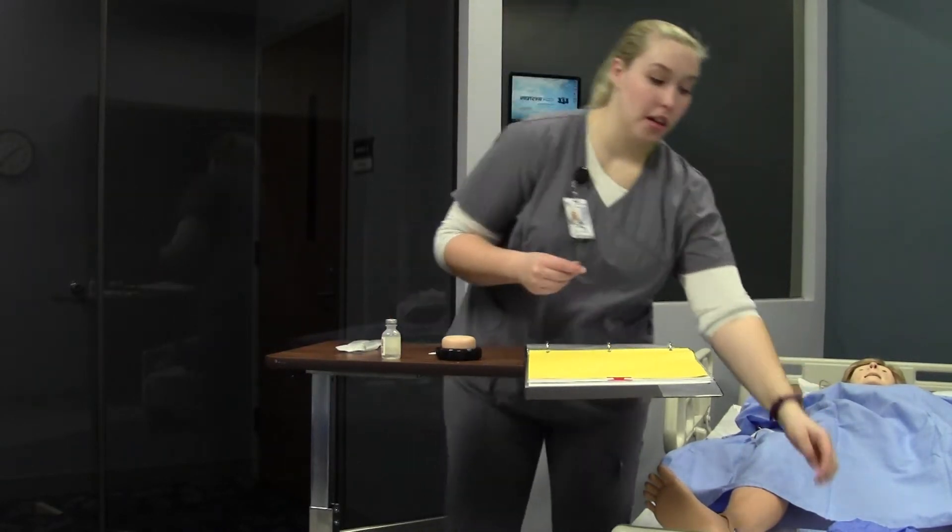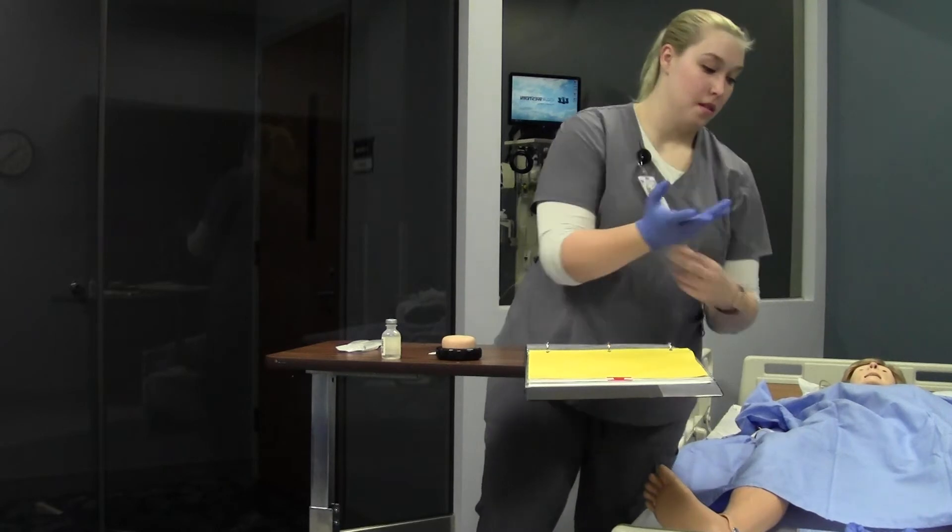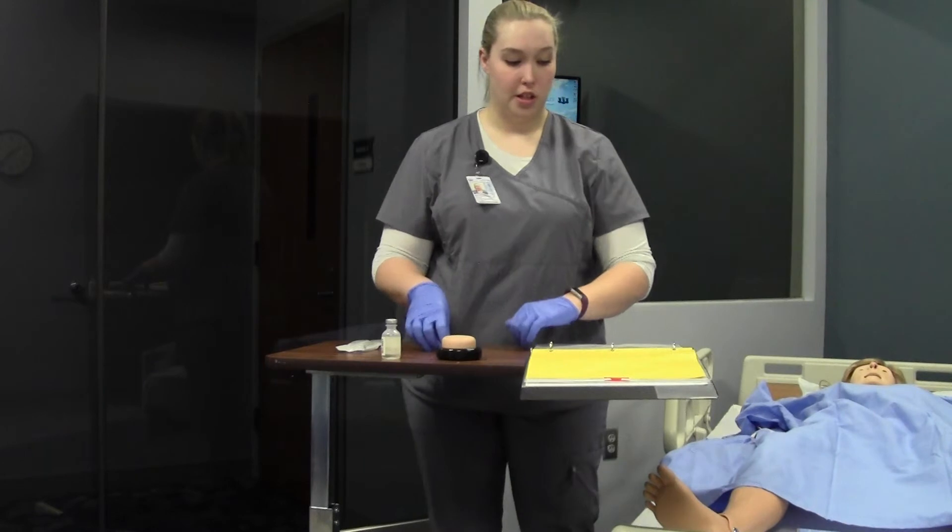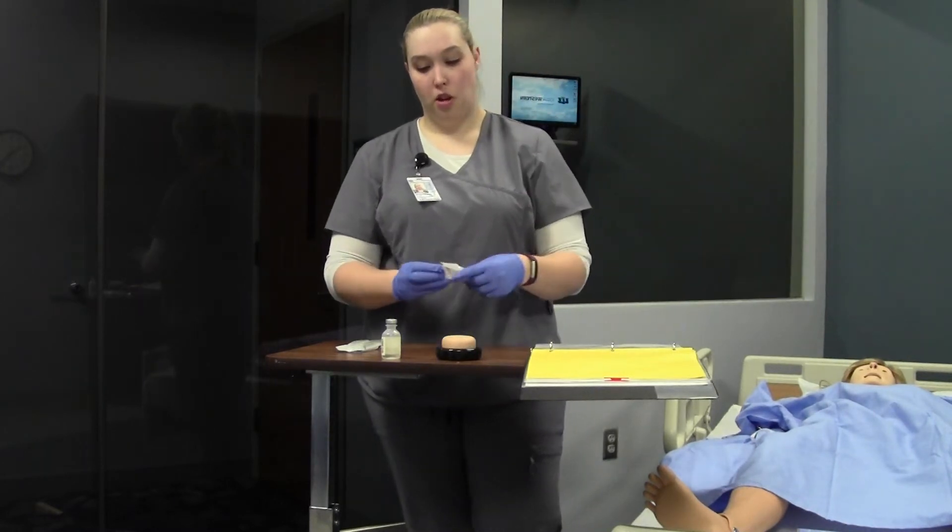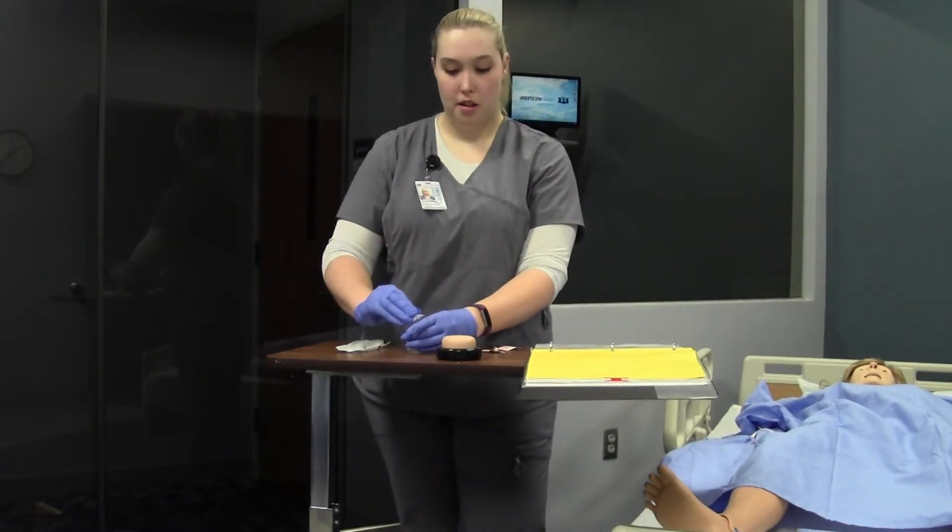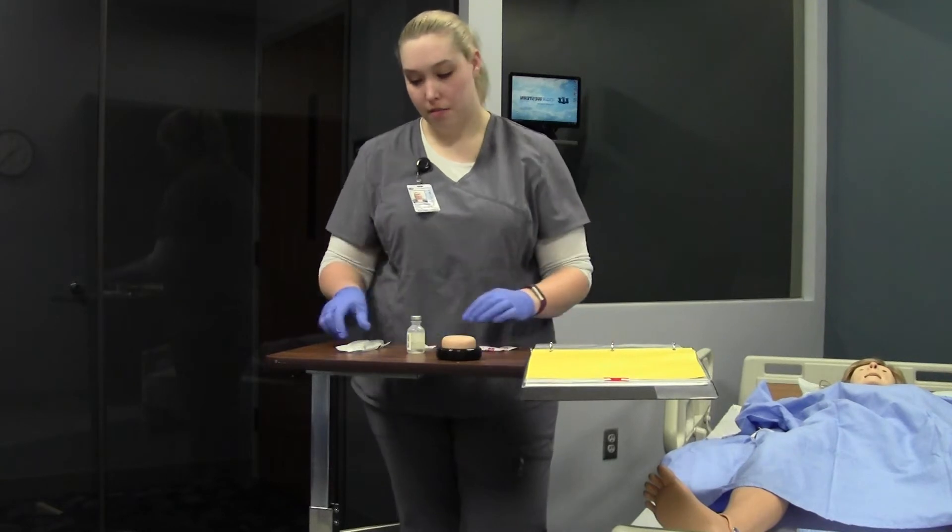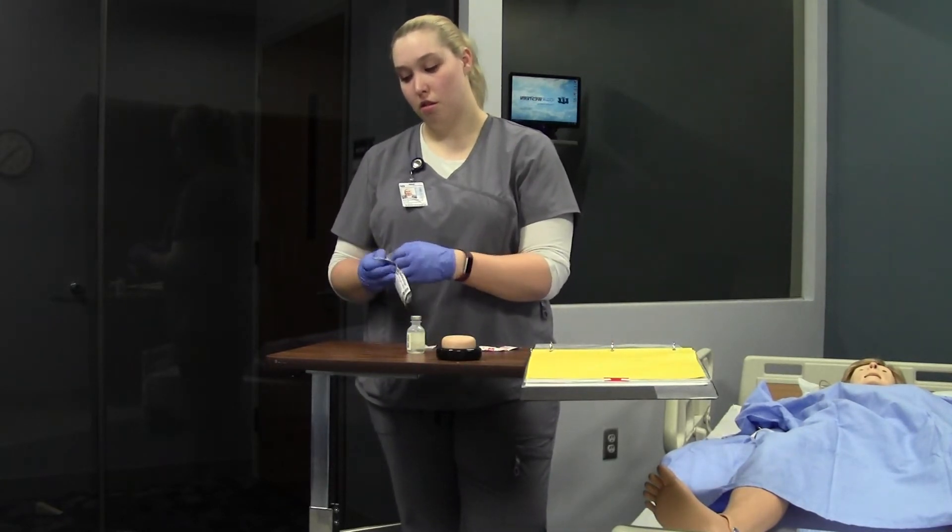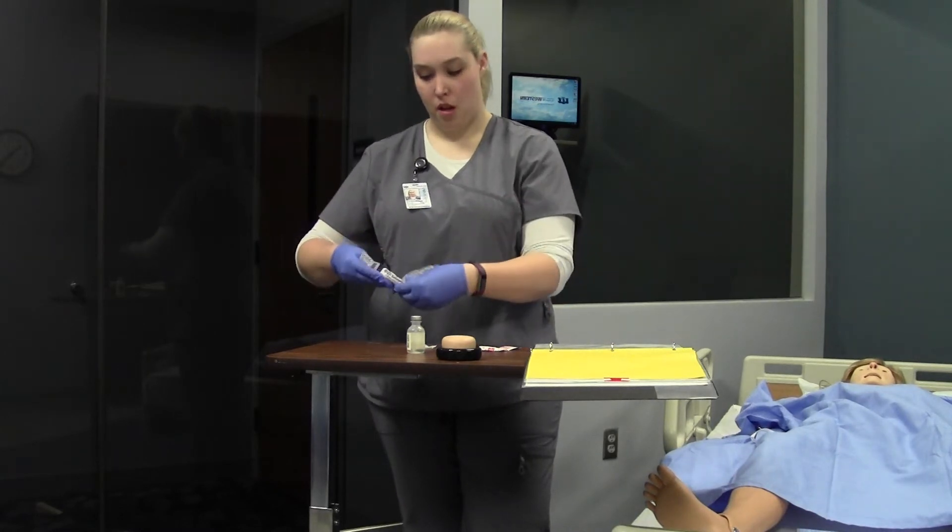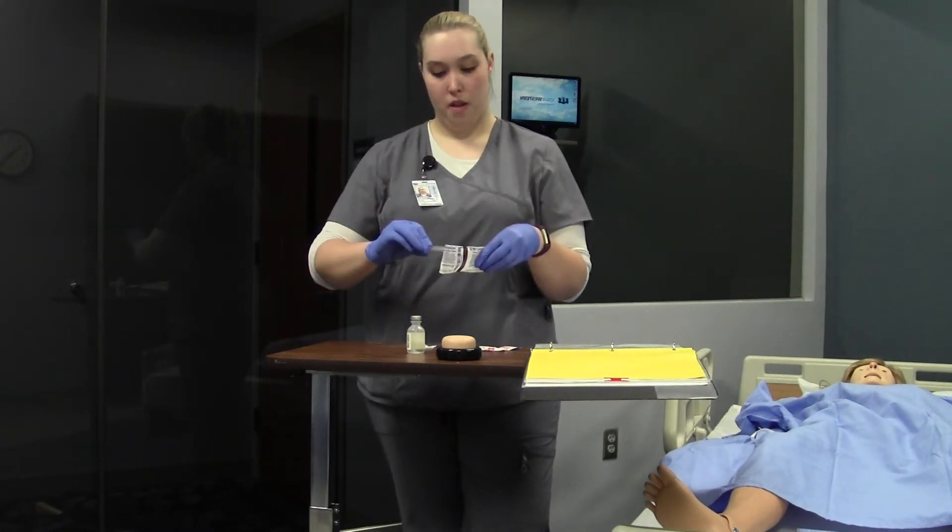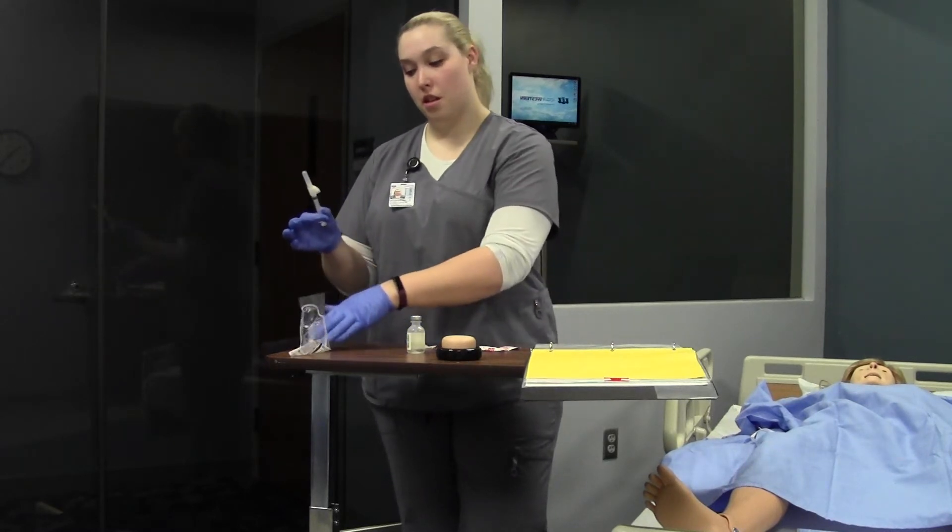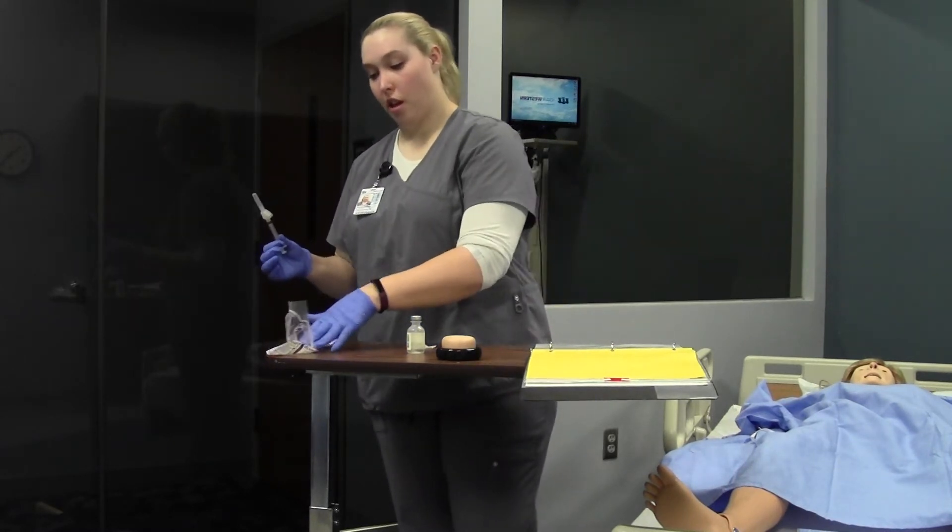Wash my hands, put on gloves. My MAR says 5,000 units sub-Q. I'm going to open and clean the top of my vial. I'm going to then open my needle and connect them, making sure that they're twisted together tight, and throw all my packaging away that I don't need.